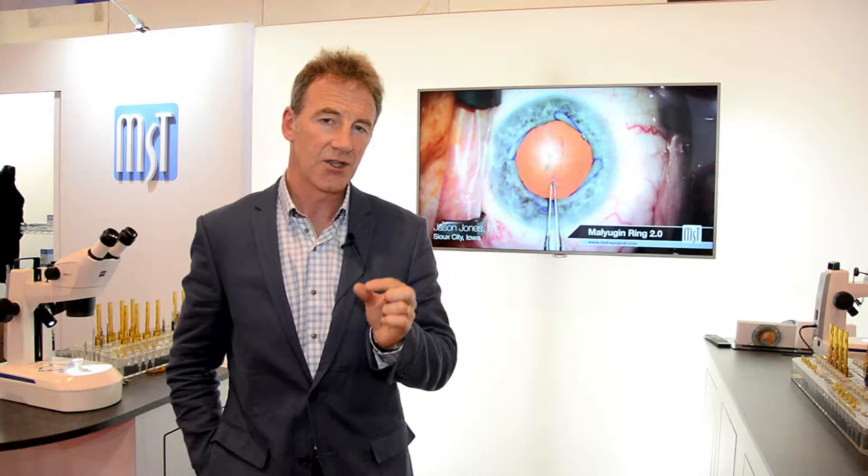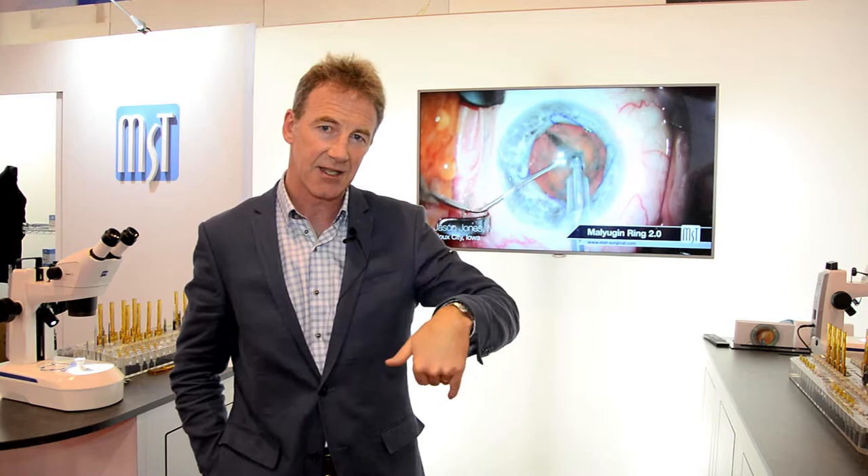The new design of MST with the double filament means they don't roll in your fingertips. The extended arm means unlike the iris retractors they extend into the capsular bag and support the whole of the capsular bag.